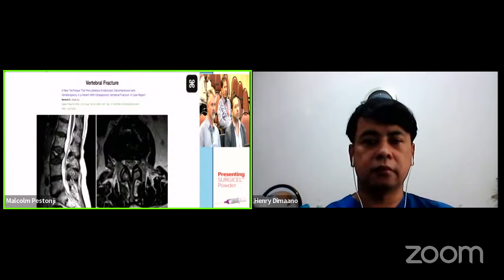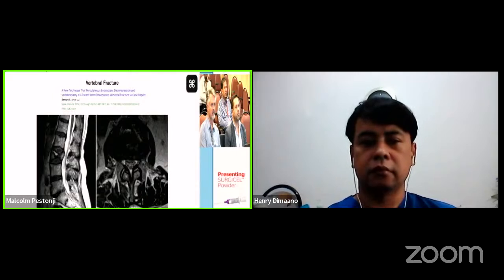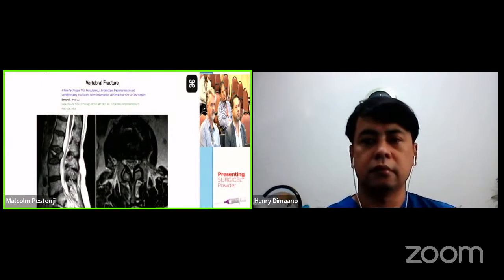Another pathology is vertebral fracture, and the percutaneous endoscopic approach is an option for this type of pathology. It is a simple case for us. The patient has back pain and left leg pain. You may see the case.